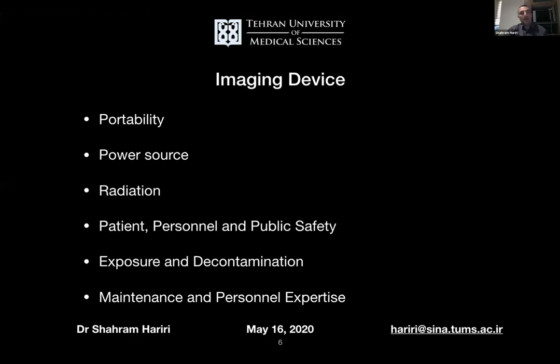Let's focus on the device itself. How can we describe a perfect imaging device or machine in such a situation? Portability should be considered an important factor during an epidemic. Considering weight, size, and power source of these machines, some may seem impossible to move around. Patient, personnel, and public safety should always be considered in requesting an imaging modality.